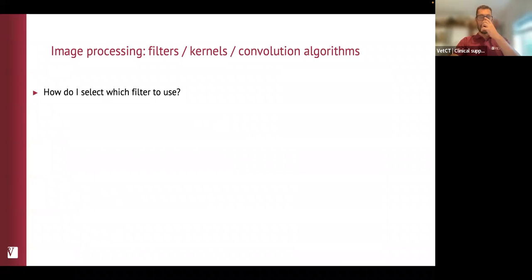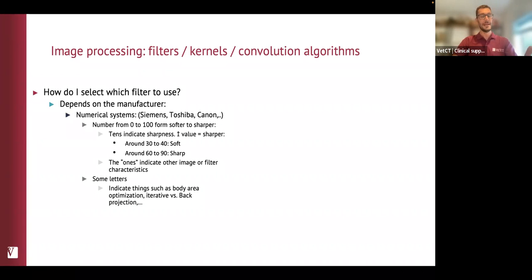Now, how do you select them? How do you choose them? If you don't know how to do this or you are unsure, you are going to need input from an application specialist, someone who knows your system, that specific brand, your workstation inside out, and they will help you with this. Because it is extremely confusing. There are totally different ways to do this depending on the system.